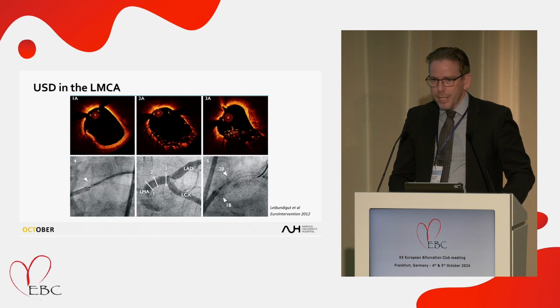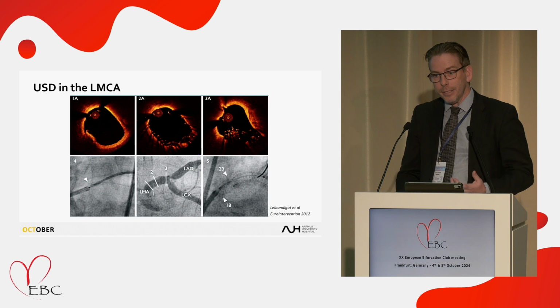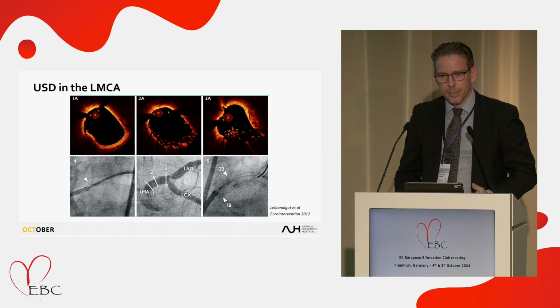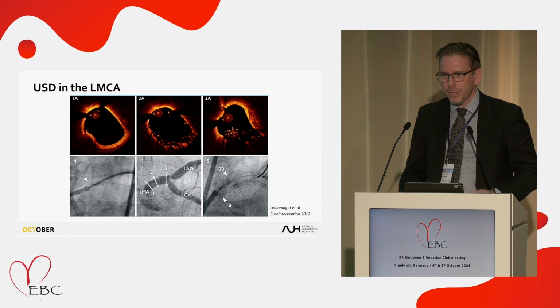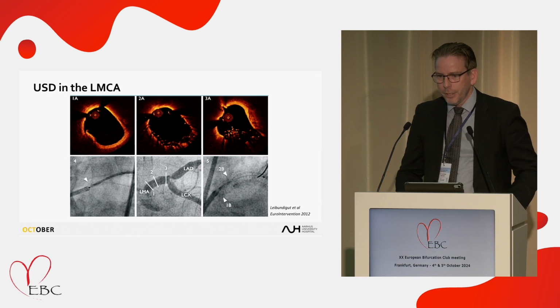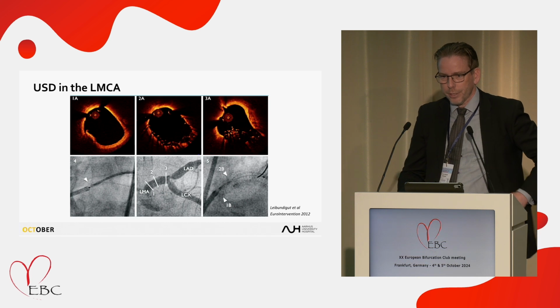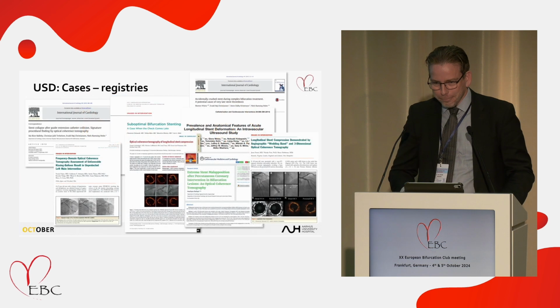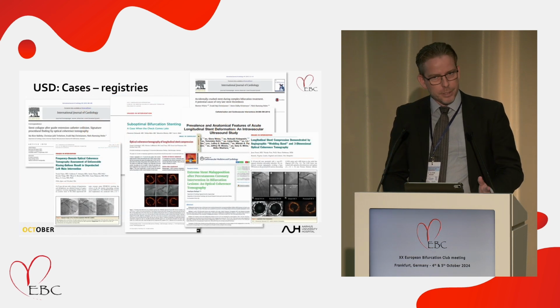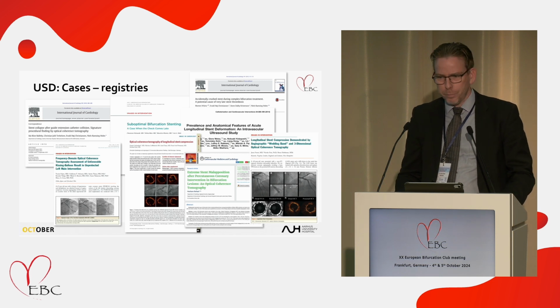We also see a combination of mechanisms here: longitudinal stent compression, and you could see the wires are outside the stent and the stent has been crushed. So here you also just have a pile of struts at the end of the procedure, and you need to clean that up. They are even pooled in the ostium of the circ here, just to increase the hazard for this patient. So there are multiple cases showing that this is a real problem, but there are very few registries pointing to this.